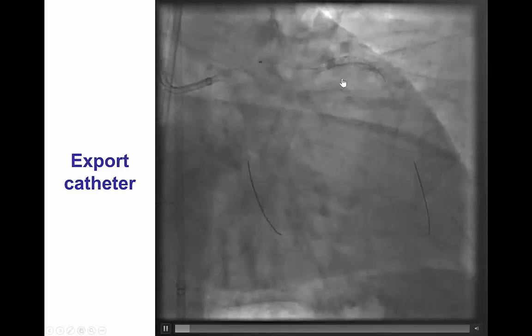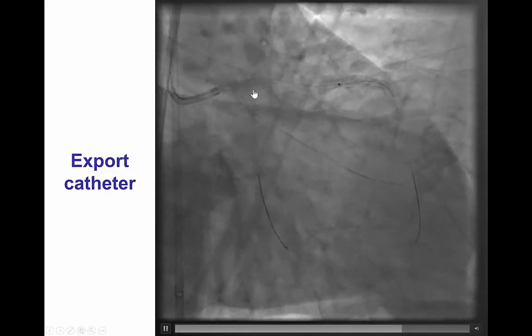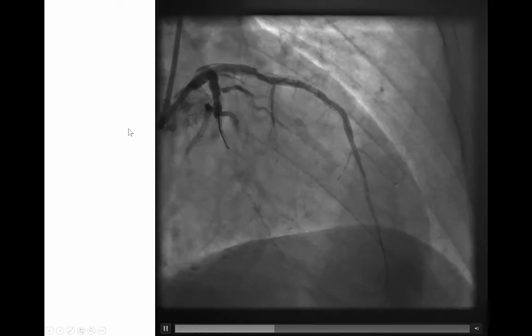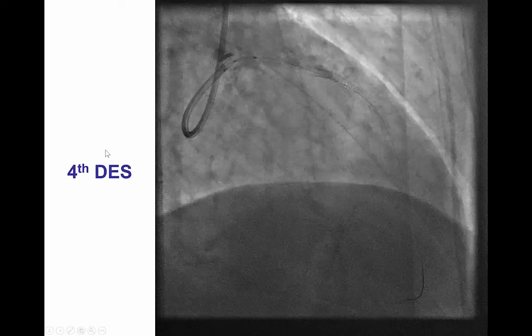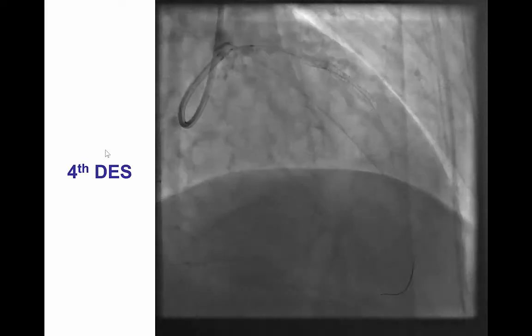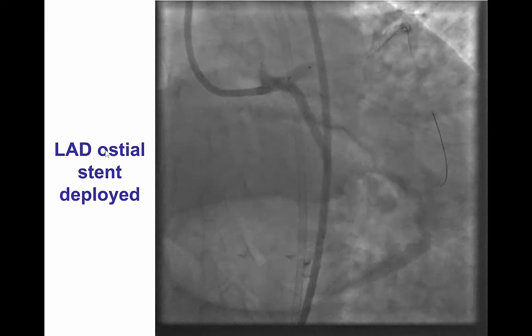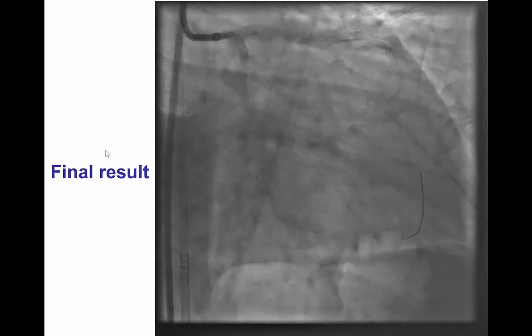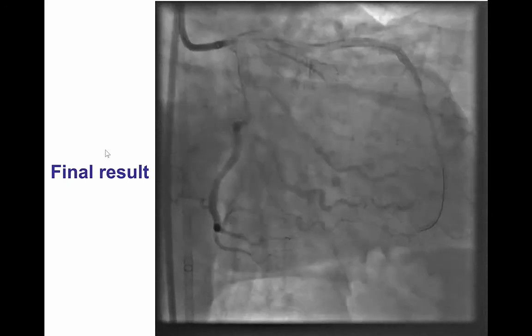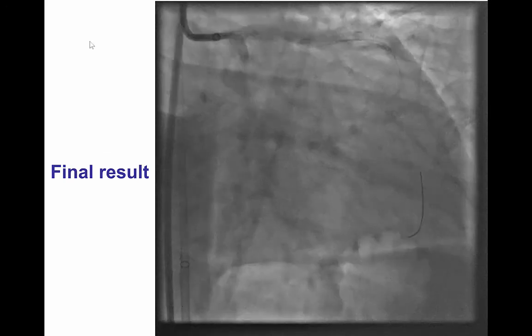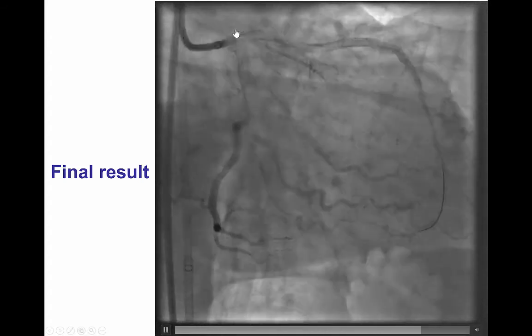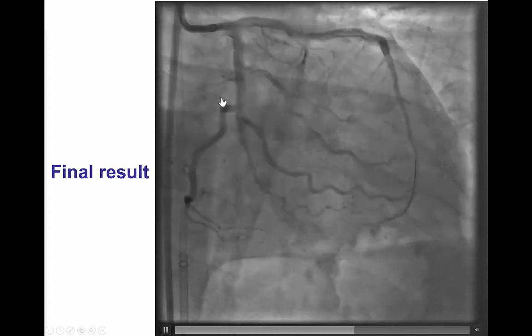The thrombus was aspirated with an export aspiration catheter, and that improved the stenosis. But we still had a dissection in the left main. Therefore, we decided for safety to place another drug-eluting stent all the way to the ostium of the LAD, and by doing that we were able to restore excellent flow in both the LAD and the circumflex. There is no longer a dissection affecting the left main.